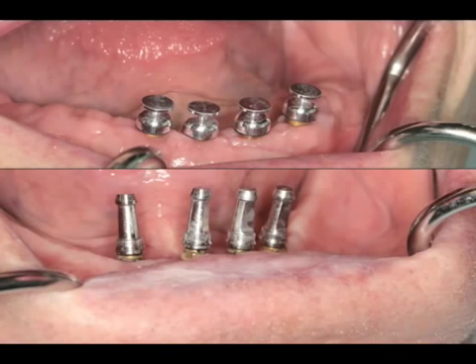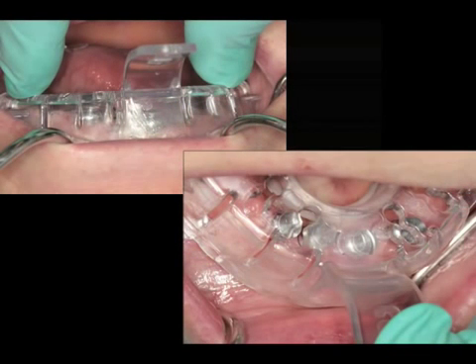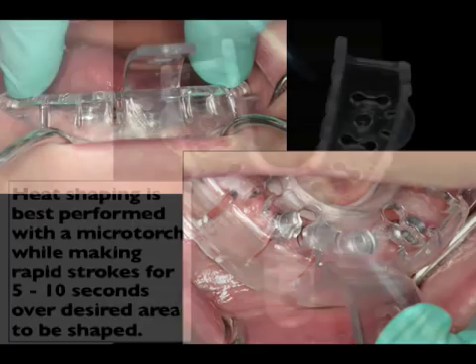This particular slide now shows both the average height impression coping as seen on the top, and on the bottom the longer type of implant impression post. The DENPLANT tray can be utilized for any height of impression post. These impression posts on the lower are approximately 10 millimeters and on the top approximately 4 millimeters. Now we want to make sure that we put the tray in and we size it and make sure it clears the impression copings, and we have space on the buccal, labial, and lingual so that the impression post generally sits approximately in the mid-center of the impression tray.